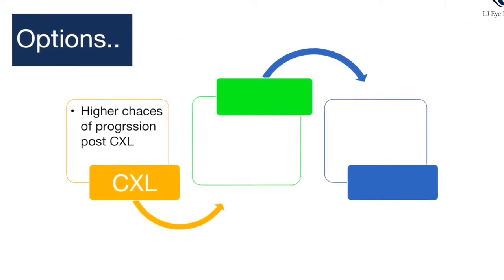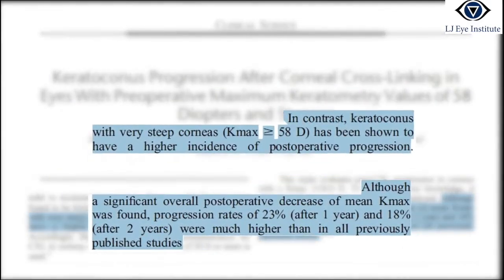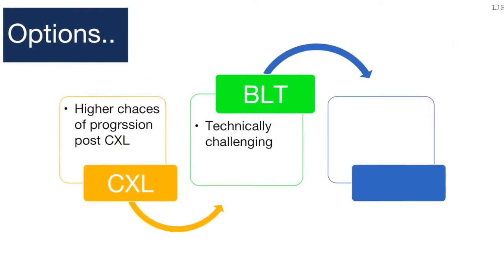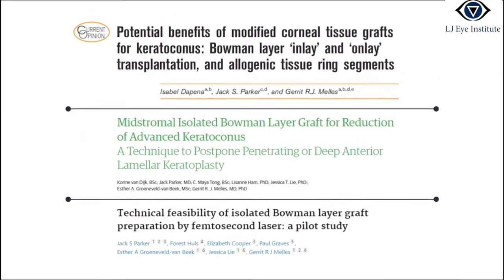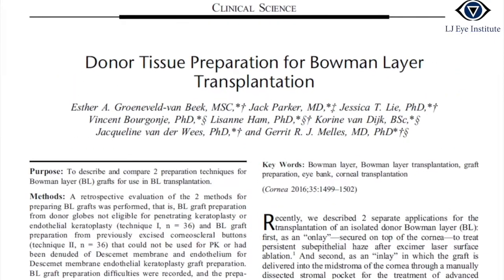So the options were to do a CXL, but with her topography, the CXL could not have been very efficacious, as it has been seen that the effectiveness is not very good in cases of steep cornea. The other option was Bowman layer transplantation. It has been found to have good results in patients with steep cornea and thin pachymetry, but the problem is that it has a longer learning curve. The surgery is technically very challenging as well.